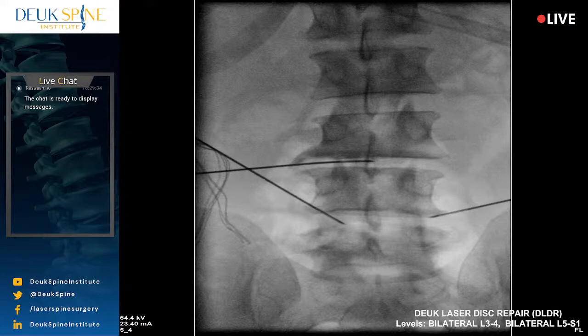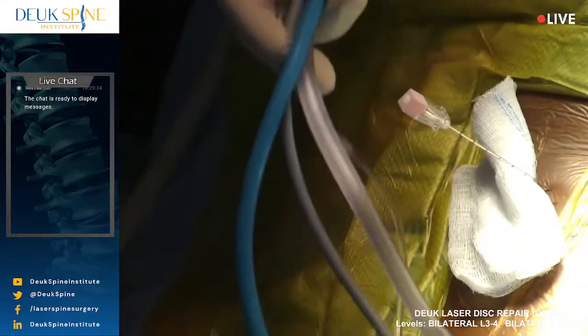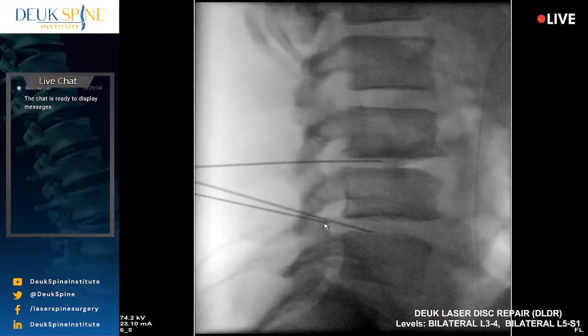You can see the herniation on x-ray. That's how big it is. One more. Yeah, we were a little bit rotated, but you can still see it. Show it to them. My God, that thing is huge. And yeah, right there. And look, show them where the facet joint is. The superior facet. You're right. Come to the superior facet of 5. Show them the anterior margin of that facet. Look, there's almost no space between the herniation and that facet. Huge herniation. We're going to get rid of that thing.